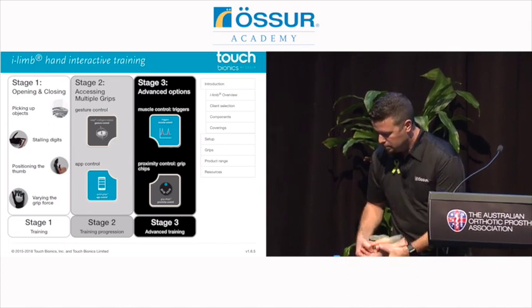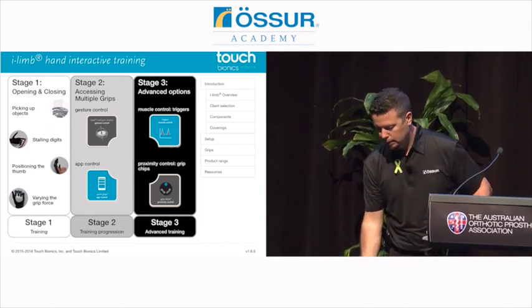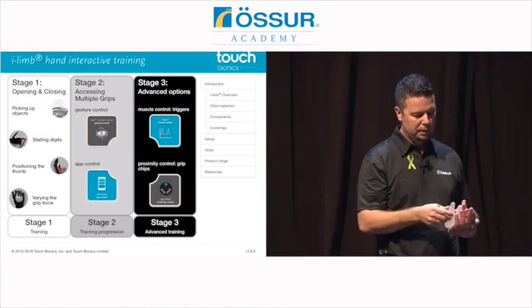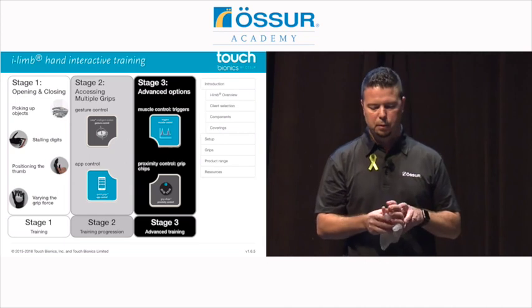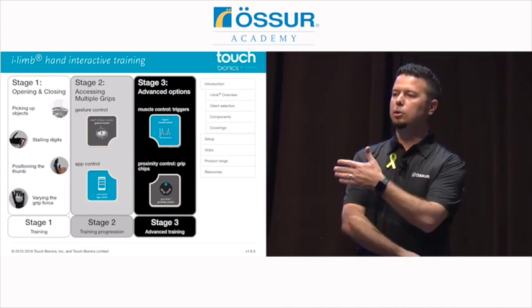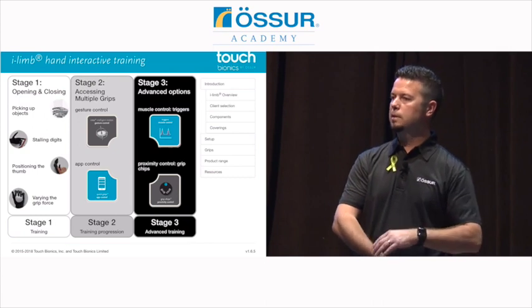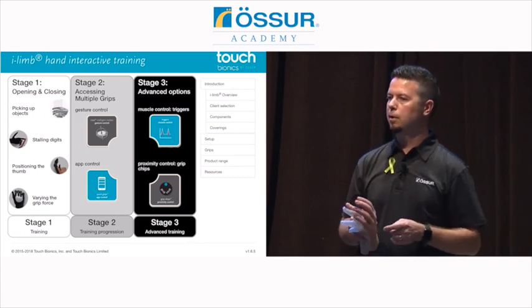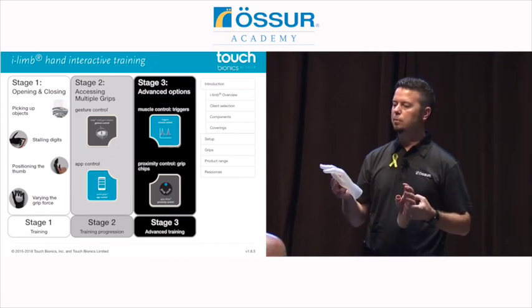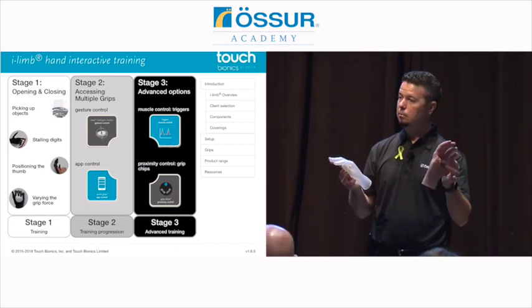That last one we talked about is painted in New York, like I was saying. And another option, these aren't for the hand, but these are living skin gloves that can be painted for partial hand amputation levels, actually any level. You could do an endoskeletal setup and they can do a skin that can go up the entire arm to cover it. But this will give you an idea of some of the level of detail that they can provide when they make an object or a hand.